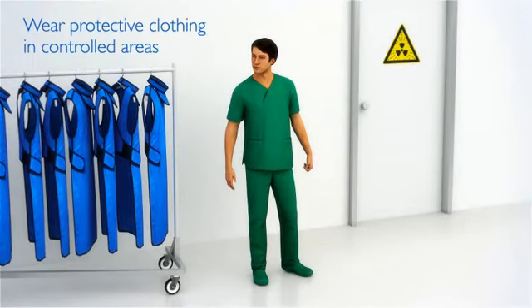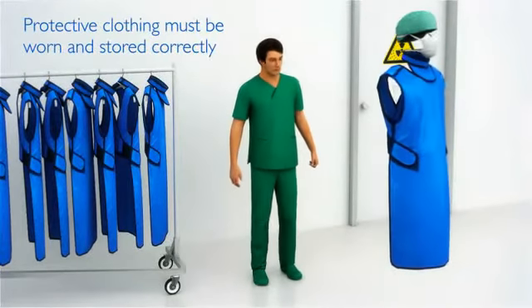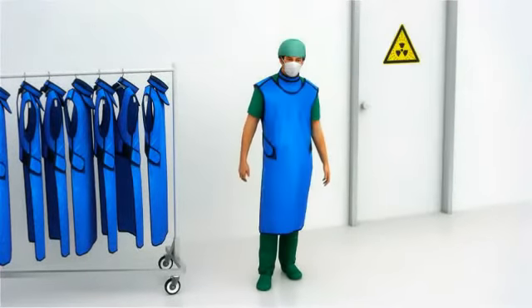Local guidelines that prescribe the use and availability of protective lead aprons, thyroid protection collars, and protective lead glasses should be followed. Protective lead aprons can be effective only if they are worn and stored correctly. Badly stored protective clothing can become damaged and ineffective.